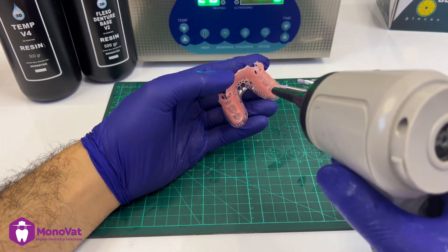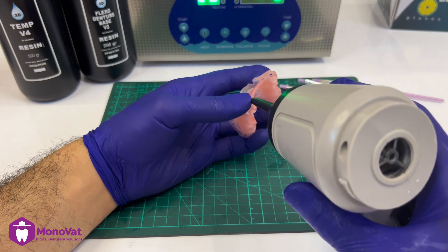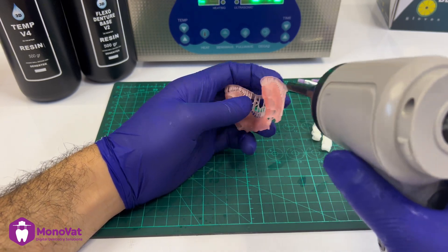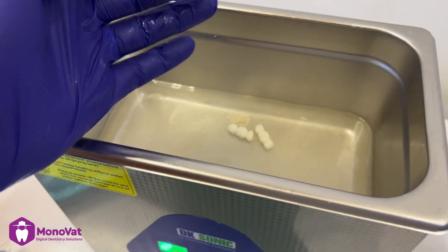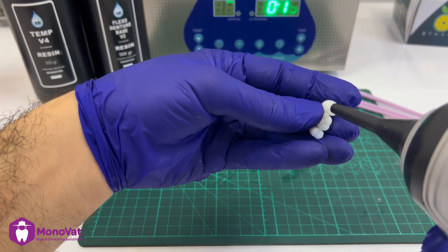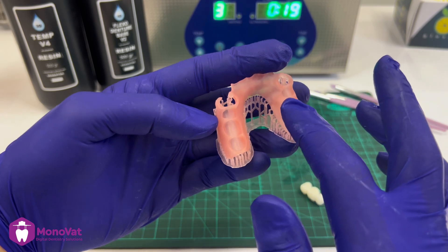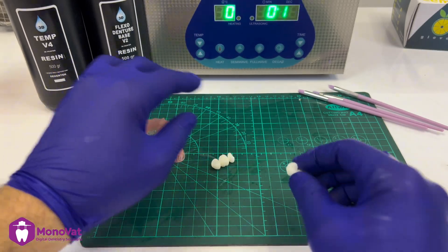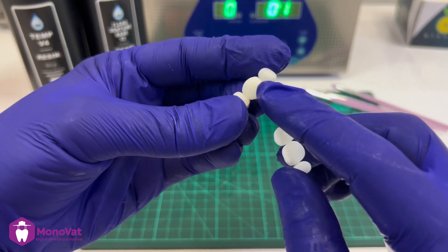After washing, we recommend drying it using compressed air so it should be completely dry for the next step. For the teeth, I will remove the support, wash using ultrasonic and alcohol spray, then dry it. Here I am checking the denture — if there is any shining or sticky place, this means it didn't wash well and we should re-wash it.